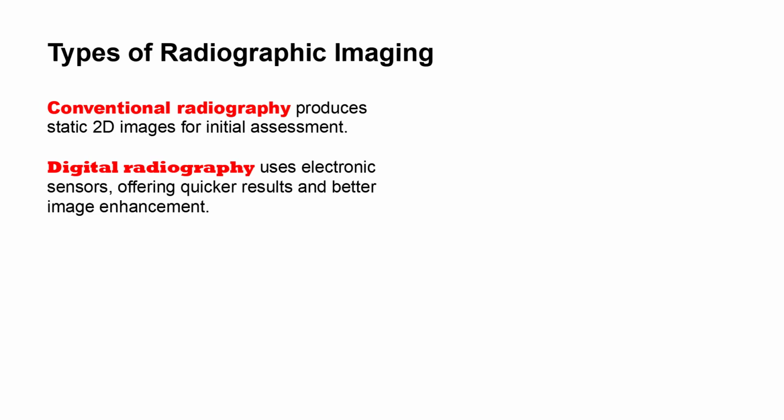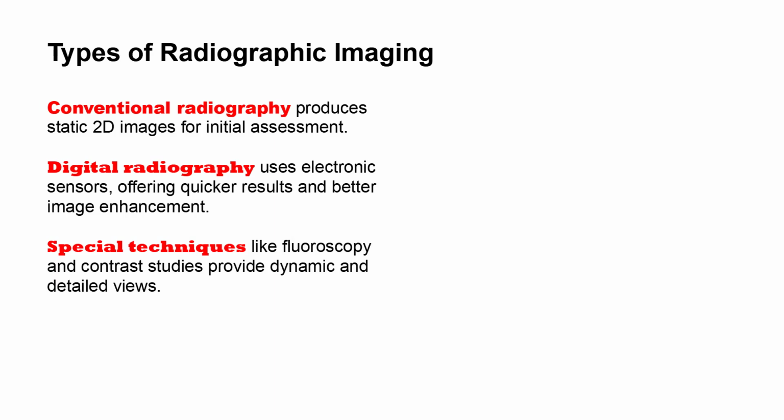That is one of the importance of digital radiography. And then the next one is special techniques like fluoroscopy and contrast studies, which provide dynamic and detailed views. So it gives more detailed images.